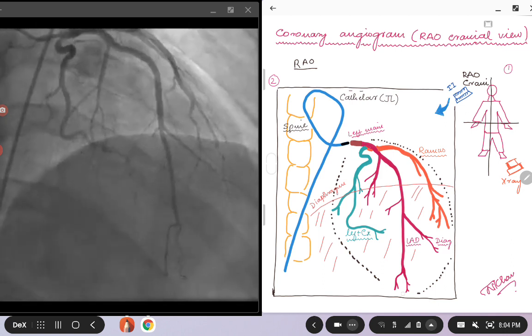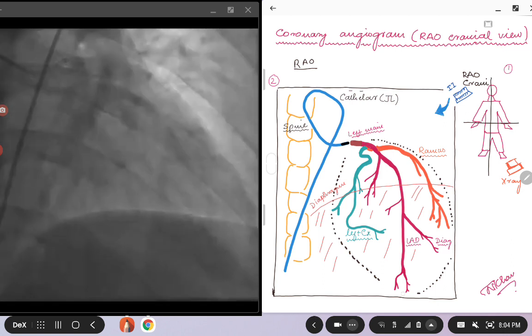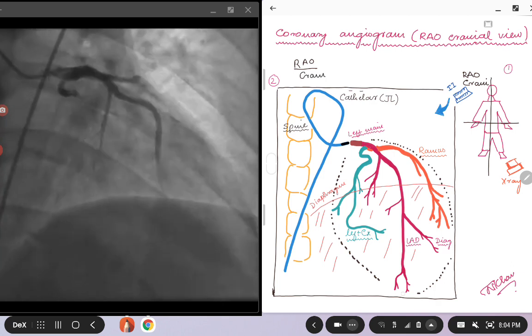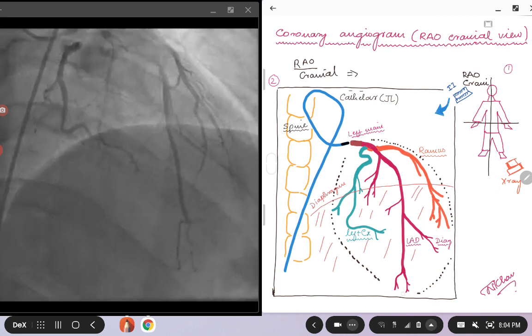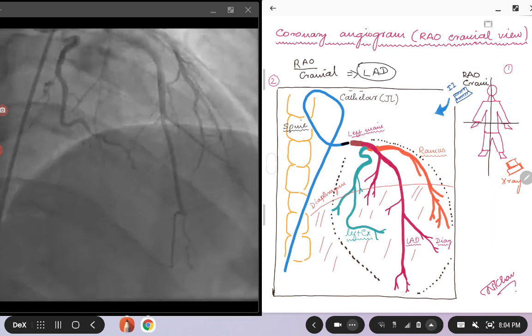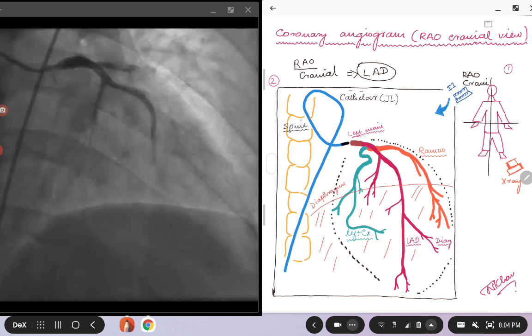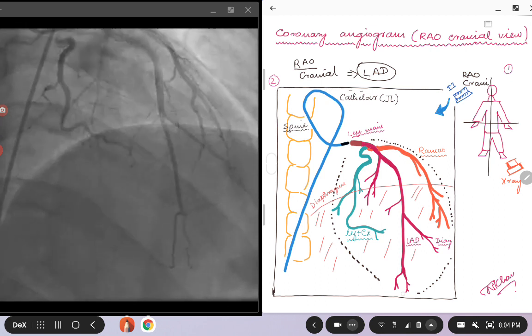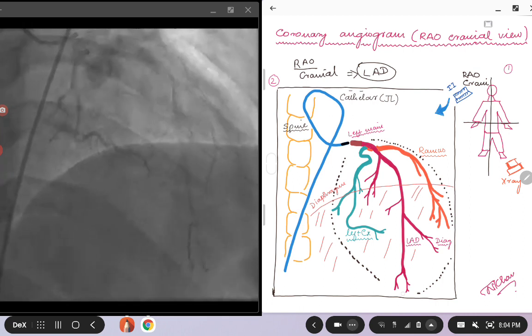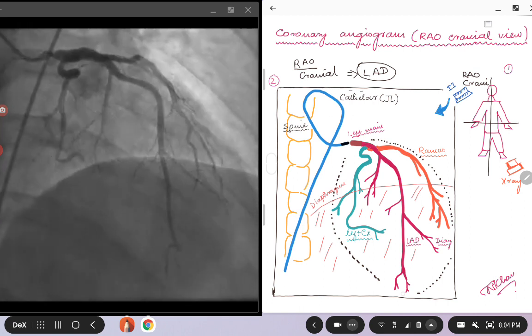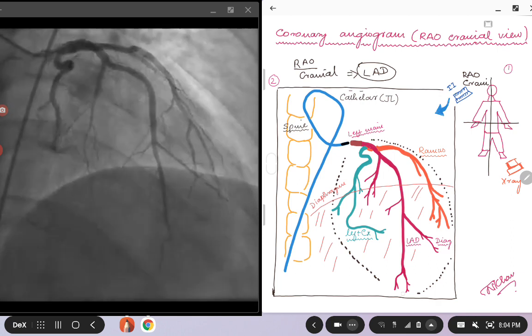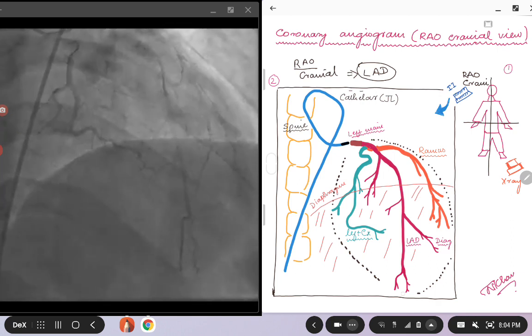We will cover that the RAO cranial, or basically the cranial views, are good for the LAD. That is important because in a cranial view, the artery that will be in the middle of the screen laid out nicely will be your LAD. So with that, we go over individual things that we will be looking in this particular view.